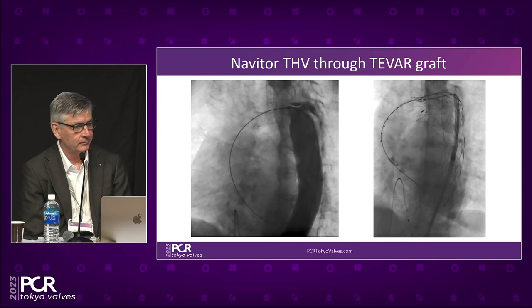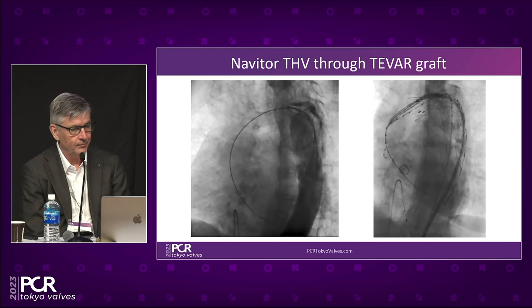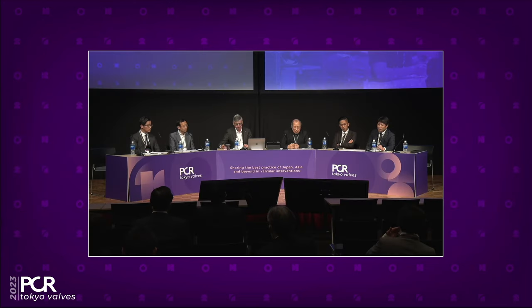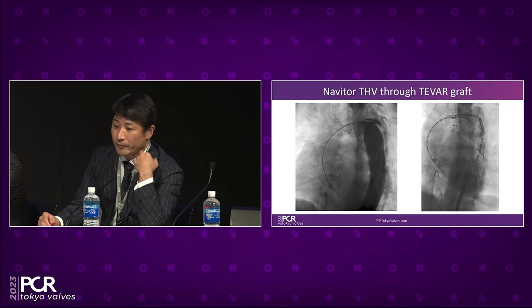Yeah, in my practice, in case of severe calcification, you always choose the self-expander valve. But I'm really interested in this concept. I understand what you mean. So the difference between the intra-annular design and supra-annular design does not have an impact on paravalvular leak, you think? Anyway, in this situation, the case presented by Moriyama, I would like to choose a self-expander valve. Okay.